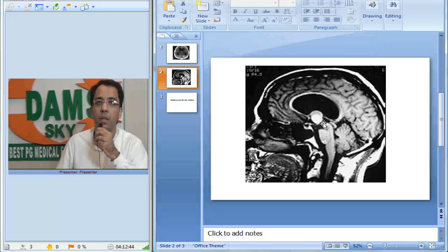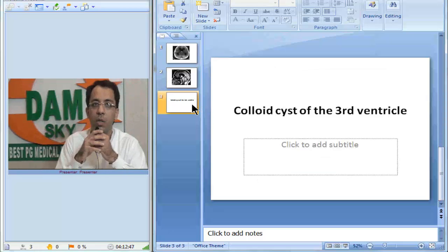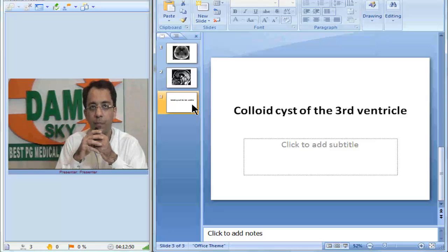So this is the anterior third ventricle in the area of foramen of Monroe, colloid cyst. Thank you.